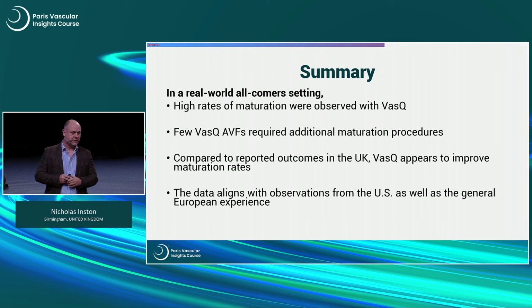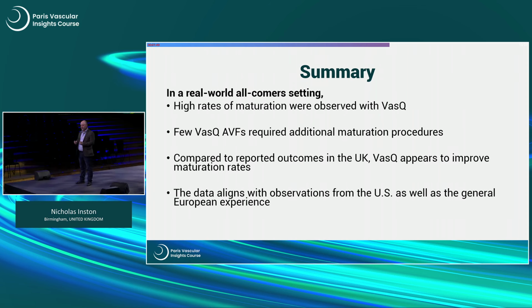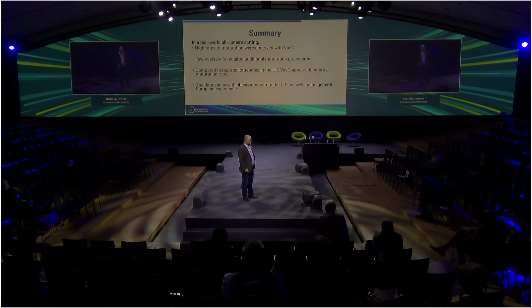So really just a very brief report here that in an all-comers setting, with unselected patients, we did see high rates of maturation. Very few of the VasQs really needed additional maturation procedures. Compared to the reported outcomes in the UK, VasQ appears to improve maturation rates, and that data seems to be consistent across a number of smallish observational studies that have been done around the world, showing that there is a benefit from using VasQ at fistula creation. Thank you very much.